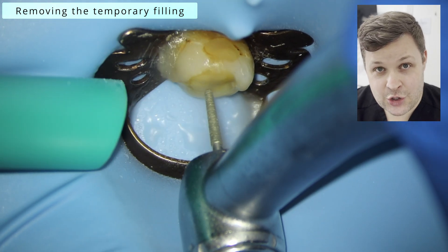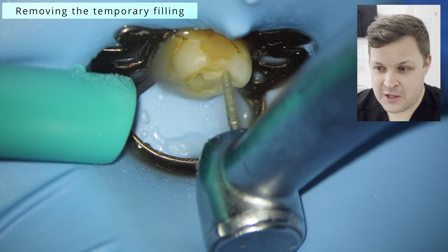Looking at the radiograph, this is a lower six with a huge area of decay distally. The canal space and pulp chamber is humongous. I'm not worried about negotiation, but distal canals with wide open spaces can split at the apical third, which is a challenge. I'm also concerned about obturation — the apex being too wide means when I push the GP point to length with sealer it could push through the apex.